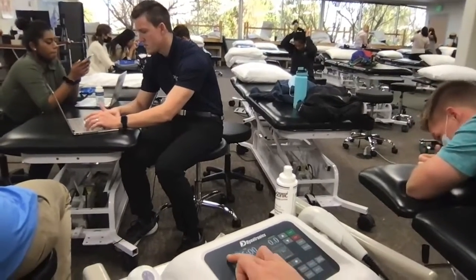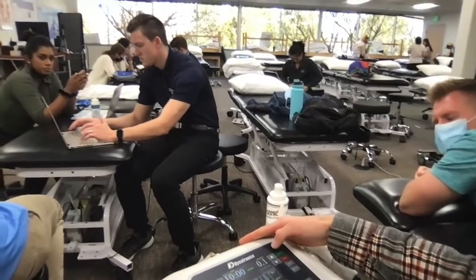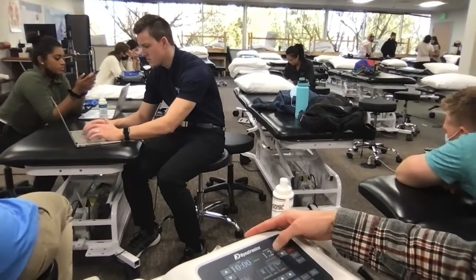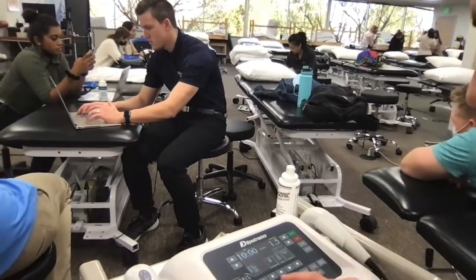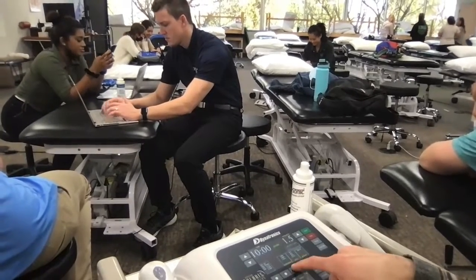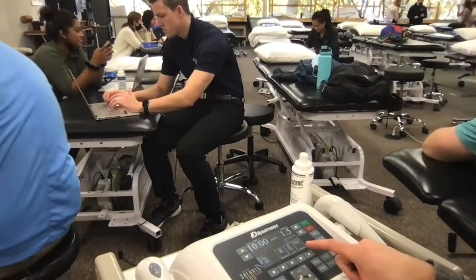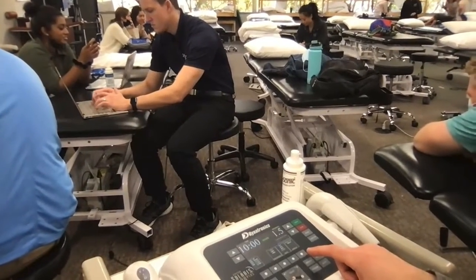Okay, so for the time, we're going to increase this to 10 minutes. For the intensity, I'm going to bring this up to 1.5. And then we're going to leave it at 1 megahertz so that it penetrates a bit deeper, and leave the duty cycle on continuous in order to have a thermal effect here.